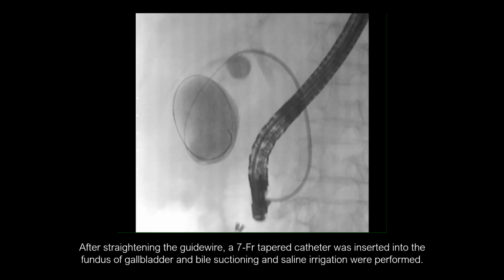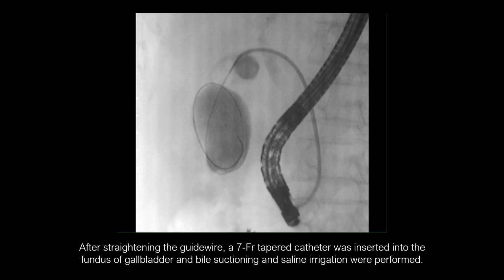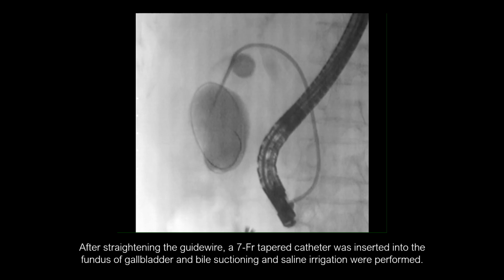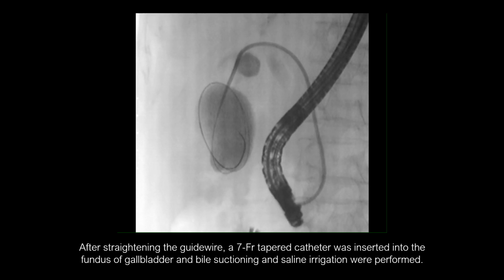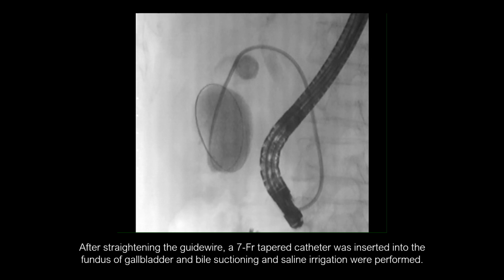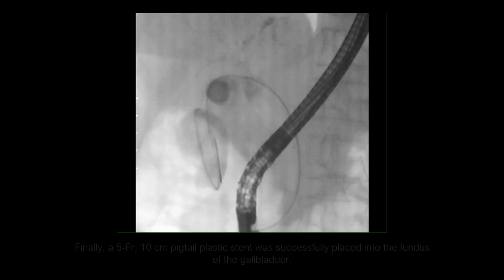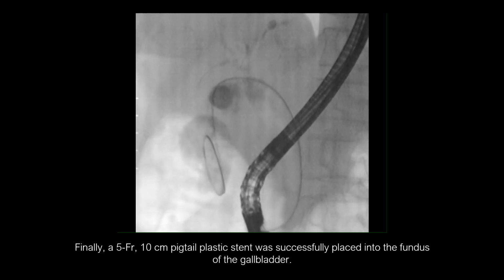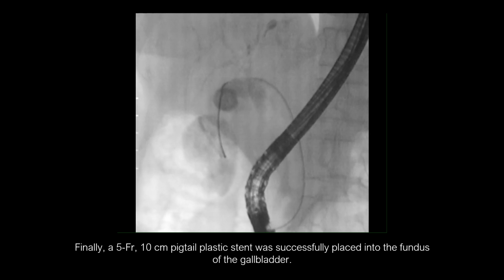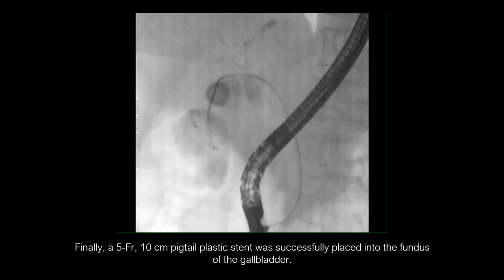After straightening the guide wire, a 7 French tapered catheter was inserted into the fundus of the gallbladder, and bile suctioning and saline irrigation were performed. Finally, a 5 French 10 cm pigtail plastic stent was successfully placed into the fundus of the gallbladder.